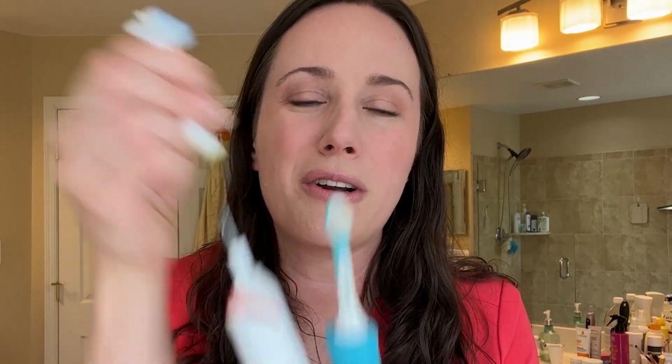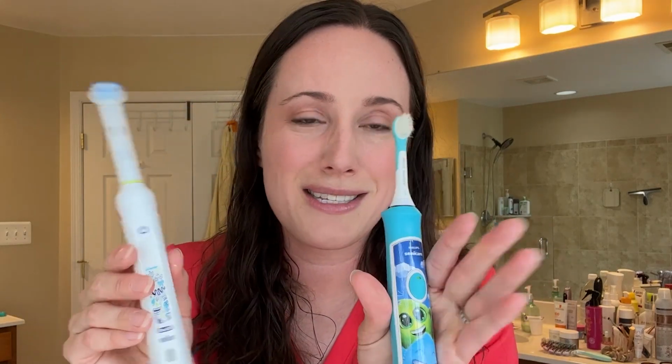I personally use an OralB as well. I own both the grown-up big fancy version of the Sonicare and OralB, and you'll see in my best electric toothbrush video that I still recommend OralB. That's my favorite. They're a little bit harder to clean, like you can get gunky stuff that builds up in here, but I find I just rinse it out afterward. I just clean it well each time, and it's not an issue. So I like the rotation oscillation type movement of an OralB versus just the vibrating of the Sonicare.